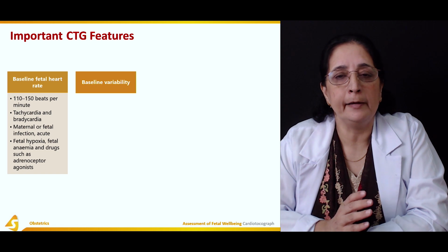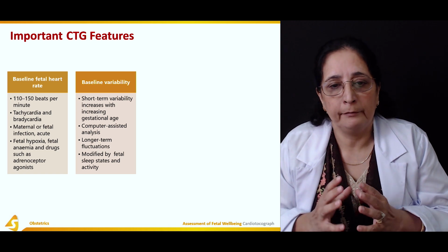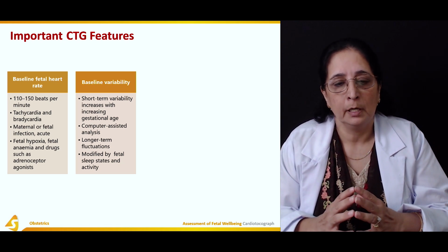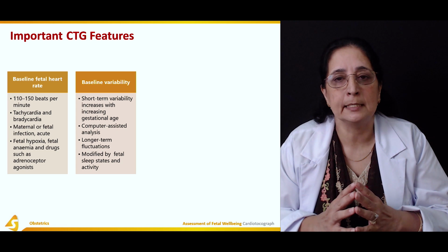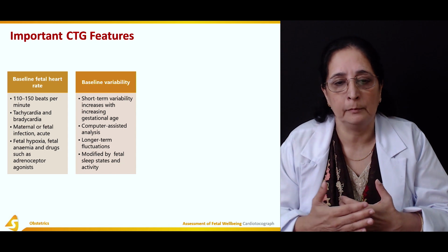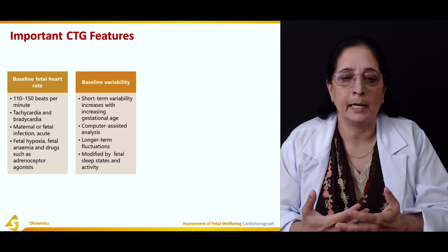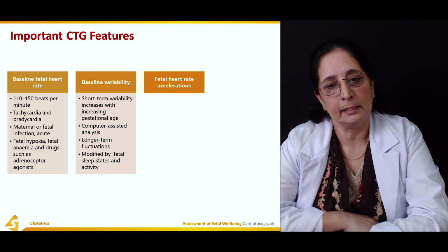Then baseline variability, variations in the baseline. Short-term variability increases with increased gestational age, and long-term fluctuation is present, which is modified by fetal sleep states and activity. So variations can occur which are short-term, long-term. Short-terms are mainly with the increase in gestational age. Long-terms are by fetal conditions or activity. Then fetal heart rate accelerations.